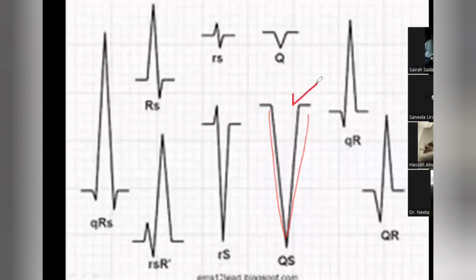That is very common. Over here, the Q wave is deep, more than 1/3 of the R wave, so this Q wave is pathological. So these are the different shapes and morphologies of the Q wave.